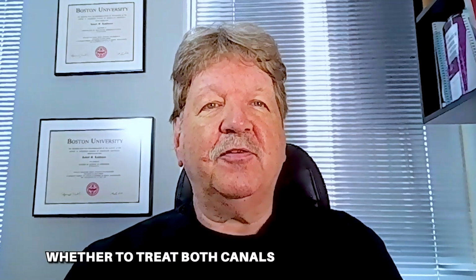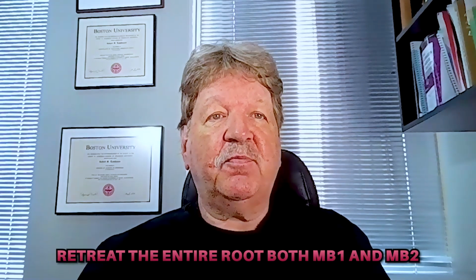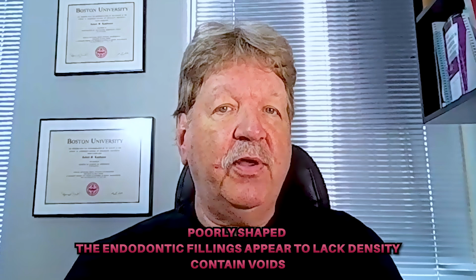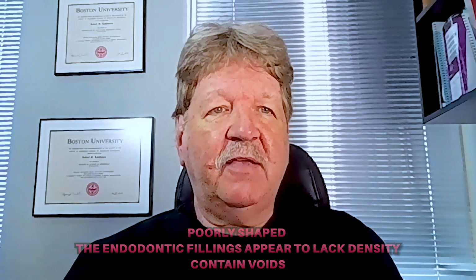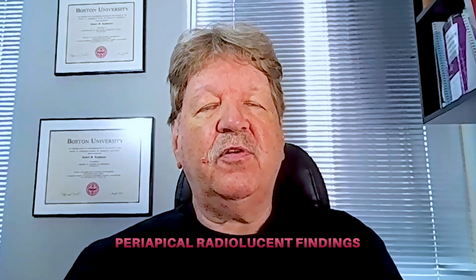This leads us to another decision, whether to treat both canals in a particular root. We know that there are frequent interconnections and anastomoses between canals in the canal system. For that reason, many endodontists will retreat the entire root, both MB1 and MB2, if they suspect this is the case. In a situation where canals have been poorly shaped, or the endodontic fillings appear to lack density or have voids, clearly retreatment of the entire case is indicated, especially in cases where these canals are associated with periapical radiolucent findings or a symptomatic tooth.